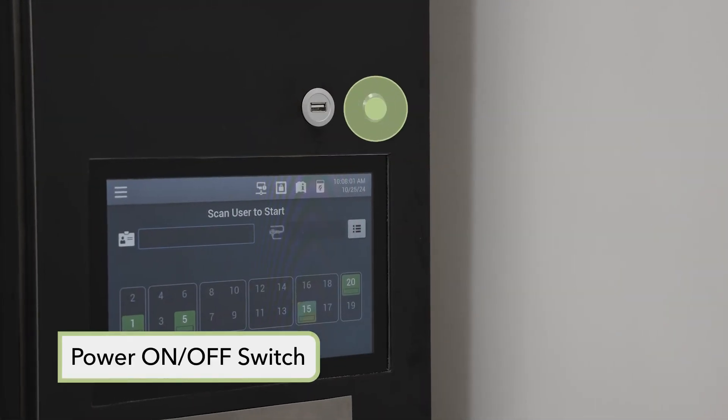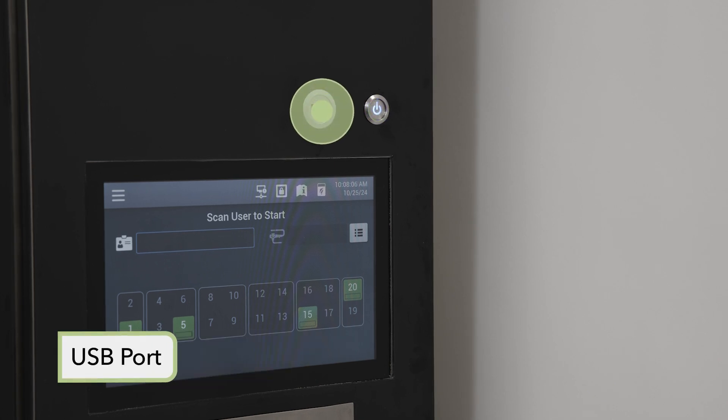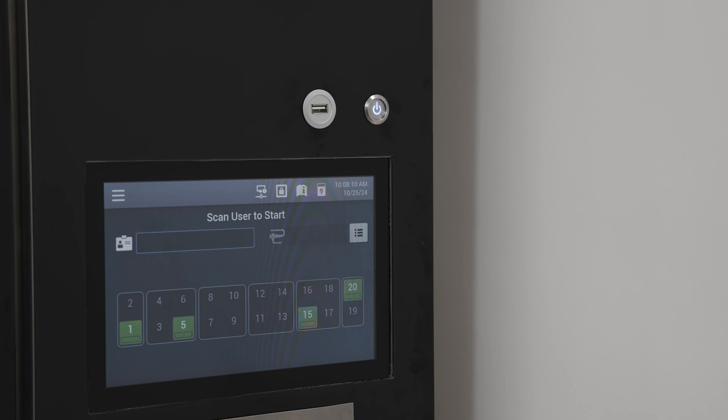An on/off push button switch is located on the front panel of the control unit. A USB port is also located on the front panel of the control unit, which can be enabled or disabled in the supervisor mode.